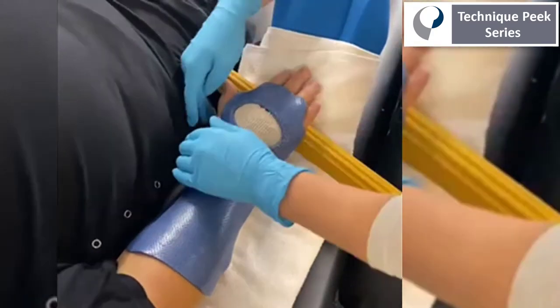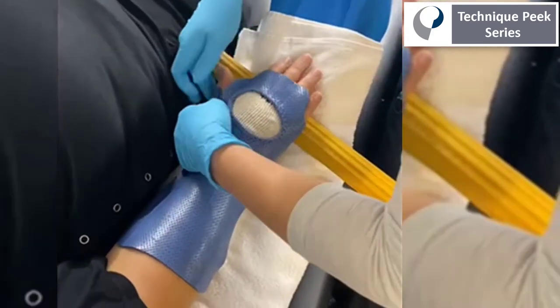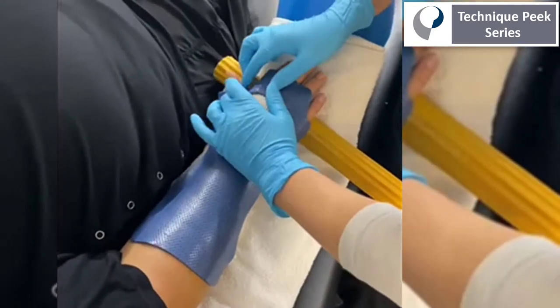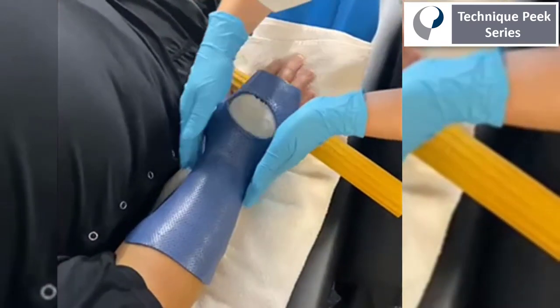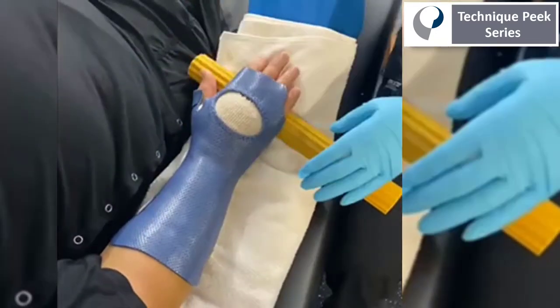Here, I'm being careful to make sure there's plenty of room to allow for active MCP joint flexion so we don't develop any extension contractures. And I'm conforming the splint material closely to the dorsal aspect of the wrist and hand.